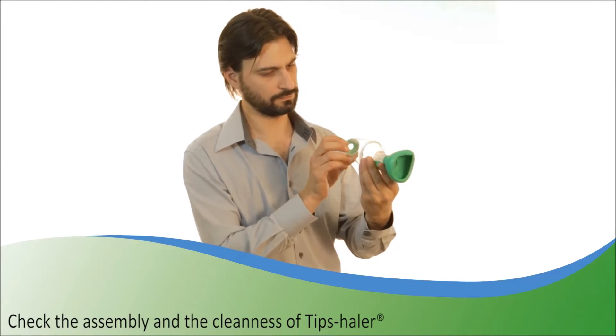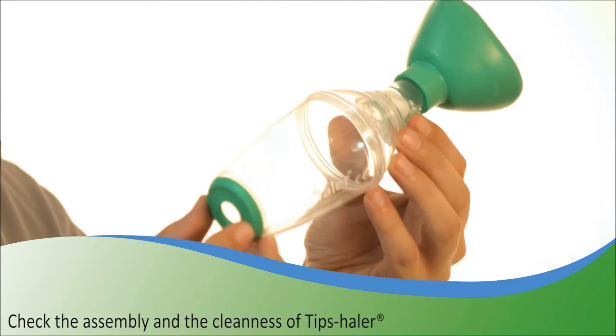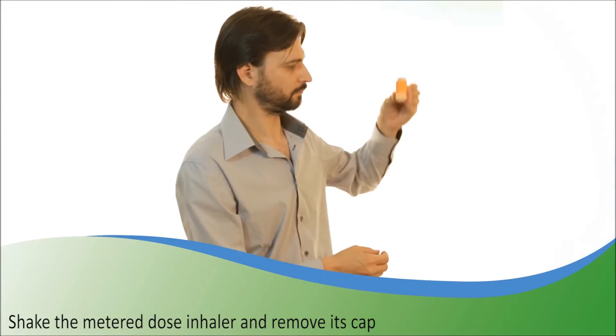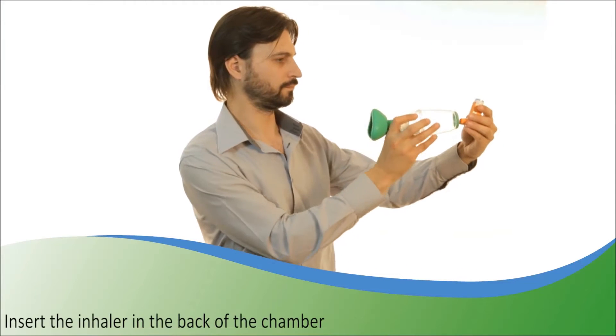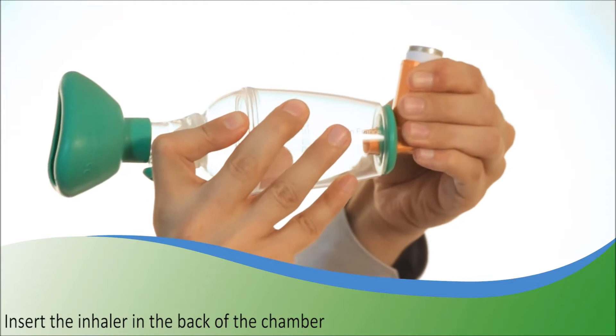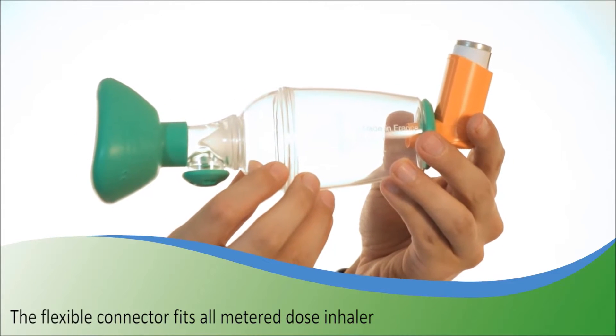Before use, please check that all parts of the Tipshaler are well connected and don't contain any foreign matter. Shake the metered dose inhaler then remove its cap. Insert the inhaler in the back of the chamber. Tipshaler fits any metered dose inhaler.